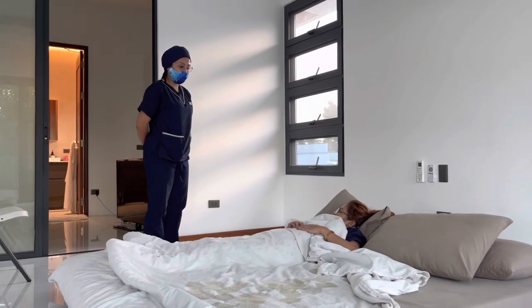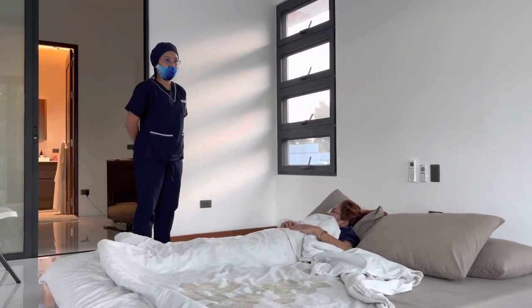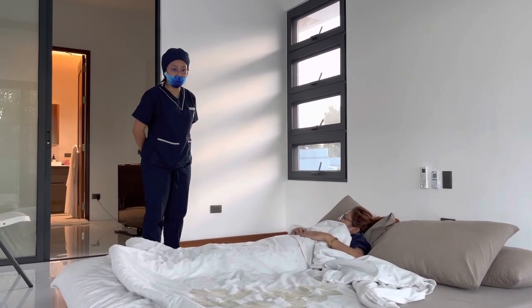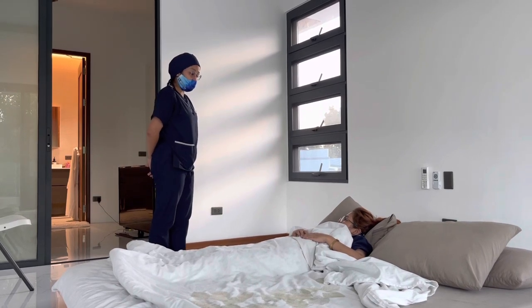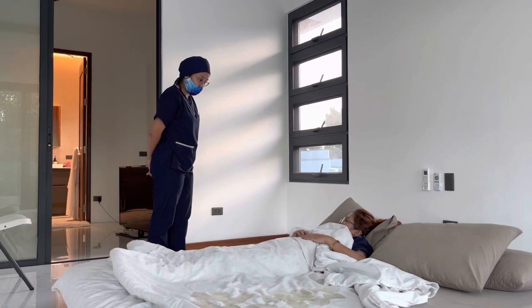First, before asking the patient to stand up, make sure that you get the patient's vital signs and inform the patient that you'll be getting the blood pressure as well. I'll be doing the vital signs. I'll be checking your temperature and your blood pressure. Are you okay with that, ma'am?